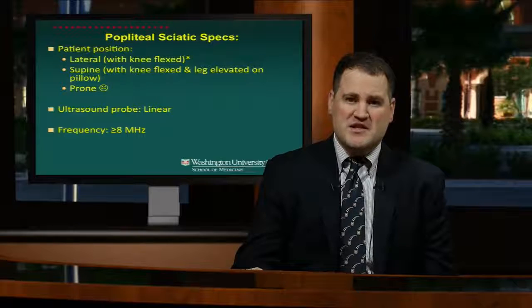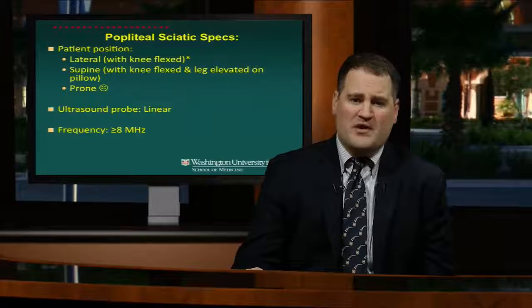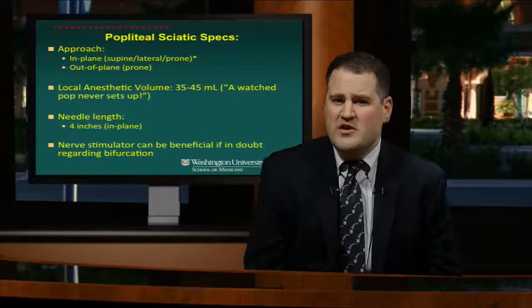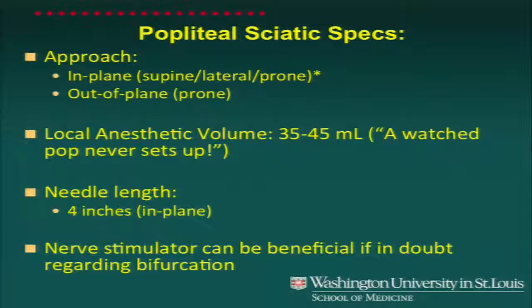The frequency is typically a high frequency probe, greater than 8 megahertz. The approach that we use is an in-plane approach. You can do out of plane. It's typically done in prone. The local anesthetic volume is around 35 to 45 mLs. And like I said, a watched pot never boils, well, a watched pop never sets up.